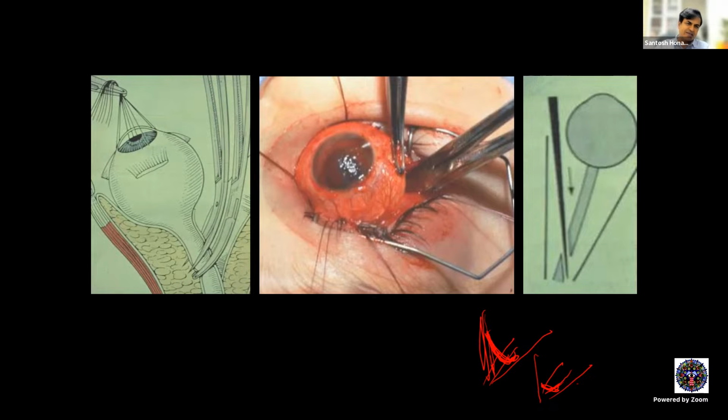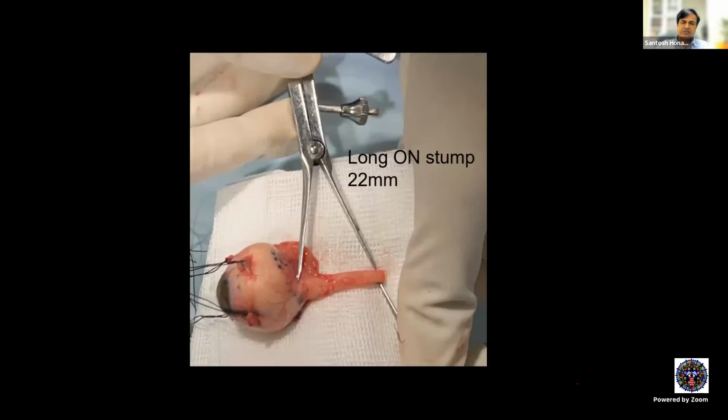It is a safety scissor because you have to really angulate it like that to go dig into the superior orbital fissure, which is very difficult for anybody to do. So that's a safe scissor. So the scissor is different.